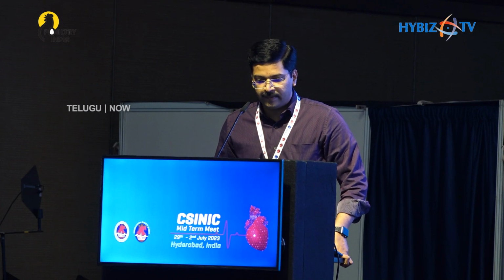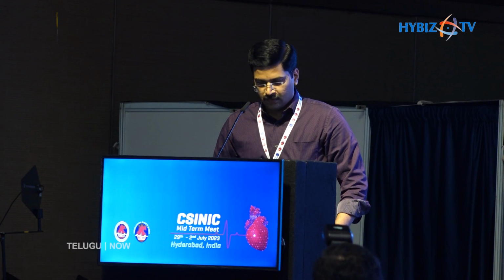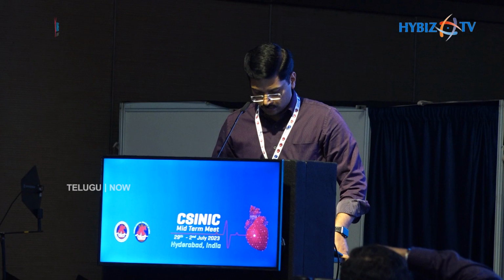So CIN has a significant impact on long-term prognosis and is independently associated with higher mortality. In patients at high risk of developing CIN, zero contrast angioplasty with IVUS guidance is safe, effective, renal protective, and it improves PCI results both short and long term. With systematic analysis, IVUS can replace most of the steps in contrast injections in PCI. The only thing worse than being blind is having sight but no vision. We were blind throughout the procedure, but we had the vision to use this great tool and to make the life of a CKD patient better.